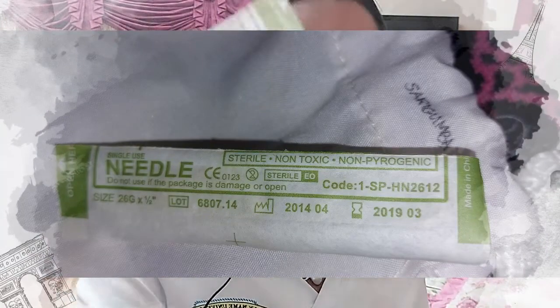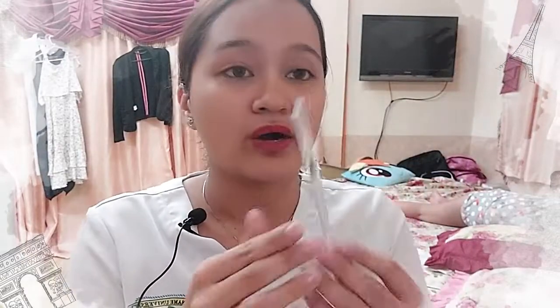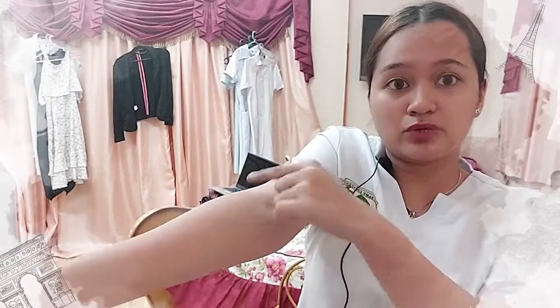I need to prepare my materials. I'll be using the number 26 needle size and a 1ml syringe. I need to double-check the right drug and right dosage. I'm going to draw out the medication from an inverted vial — it's going to be 0.1cc for an allergy test, and the rest will be distilled water, which will be 1ml total. I need to identify the injection site, which is 2 to 3 finger widths below the antecubital area.